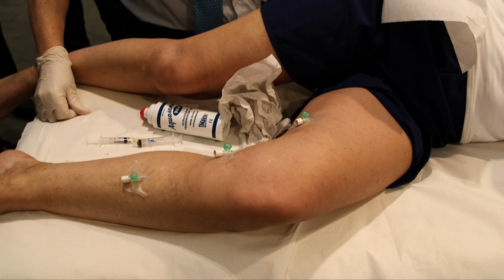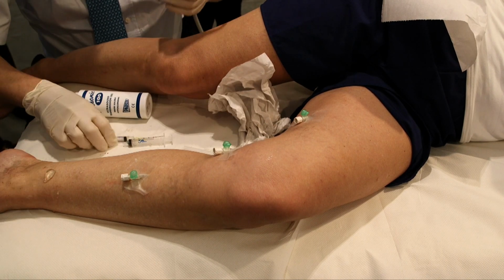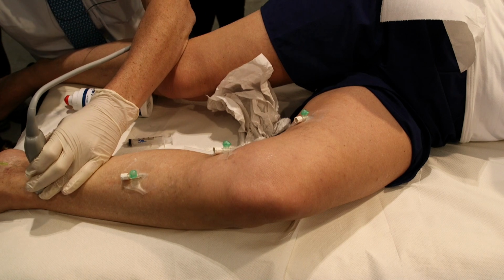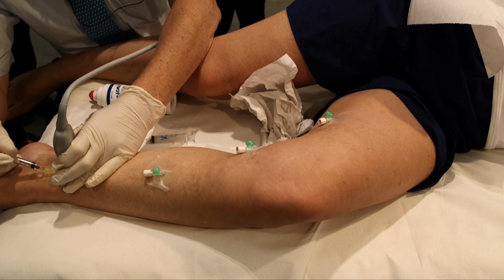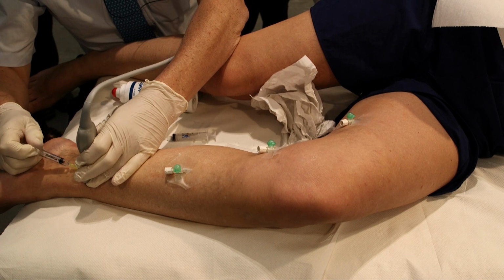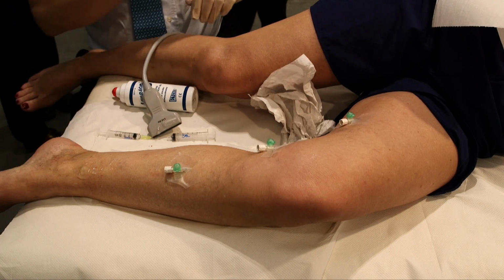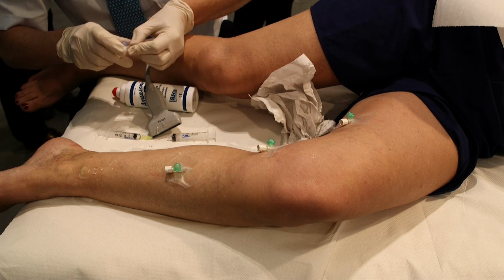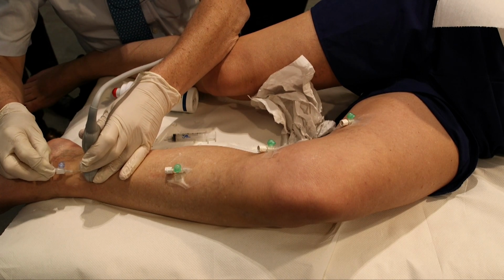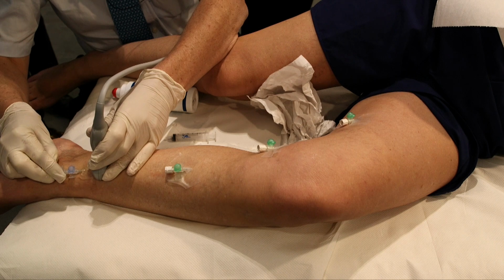And then we just come down towards the ankle. When I first did foam sclerotherapy, we never used to inject the saphenous vein down here. Just going to do another injection. I'll have a blue one, please, Kate. Just occasionally, the saphenous nerve arborizes around the vein here, and when we hit the vein, we hit the nerve as well. So I'll put a drop of local anesthetic in the vein wall at the same time. Unfortunately, this bit of saphenous vein commonly does give rise to further varicose veins, and so I always put a little bit of foam in down here these days.